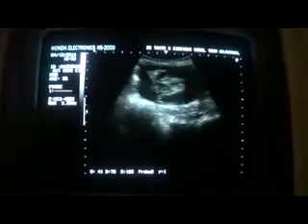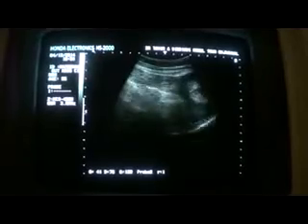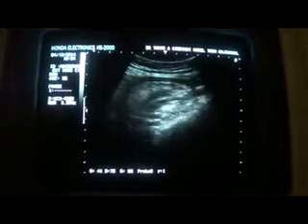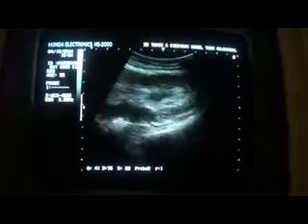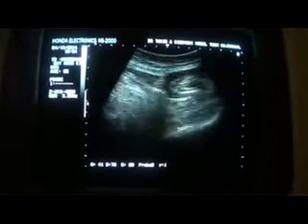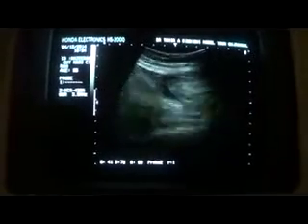The whole of the bowel, starting from the left upper abdominal quadrant and then extending into the lower abdominal quadrant, and from here extending anterior to the urinary bladder in the suprapubic region. Here I am with a dense, coarse, echogenic area at its most distal end.